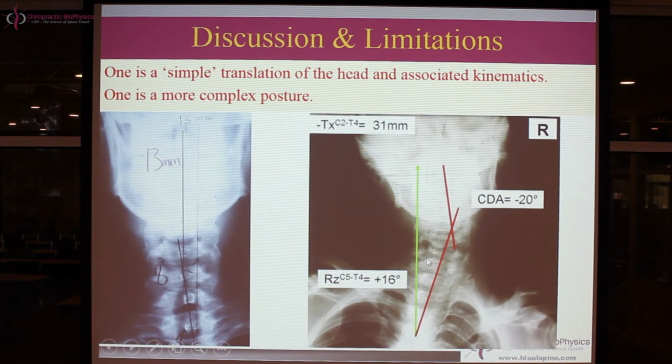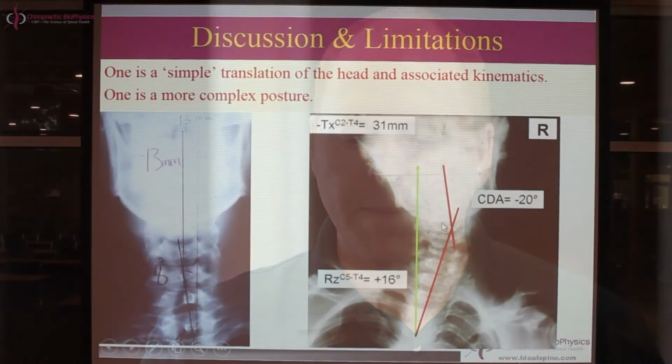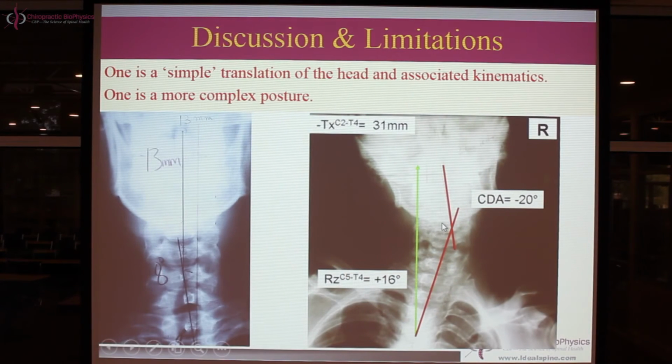The other issue is, if you'll note, the doctors will pick this up easier than a patient out there. These are my spinous processes. My spinous processes should not be this far towards the midline. We have a problem. So now we see a big twist in these vertebrae. They're not supposed to be twisted that far. They're supposed to be closer to the midline on this red line for this particular posture. These are way over here. So there's some kind of issue going on.